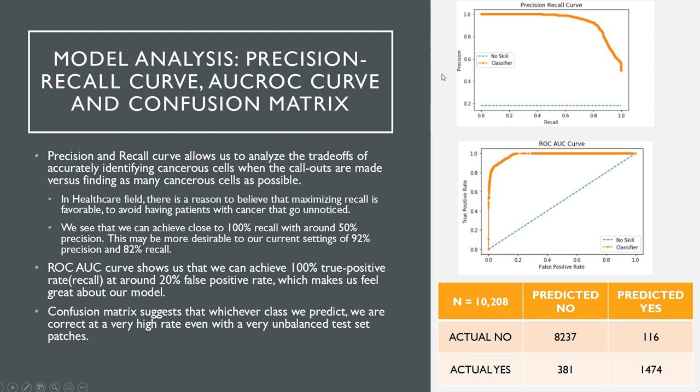Here we'll talk about the trade-offs, right? So we talked about that recall and precision trade-off. What this is showing is that we can get to 100% recall by changing the probability thresholds. We'll lose precision, right? We'll get to 50% precision, but we can accomplish 100% recall.